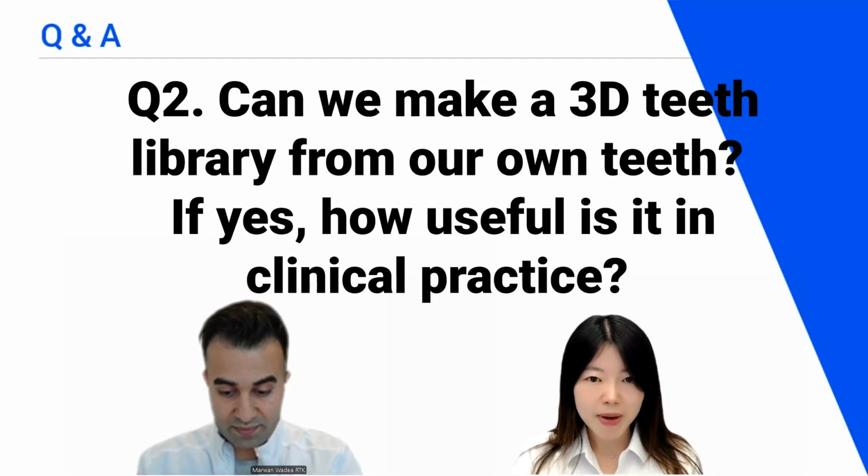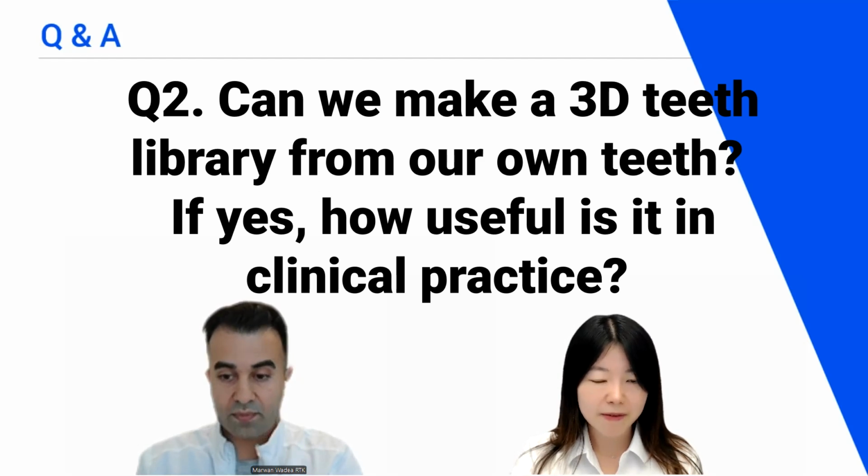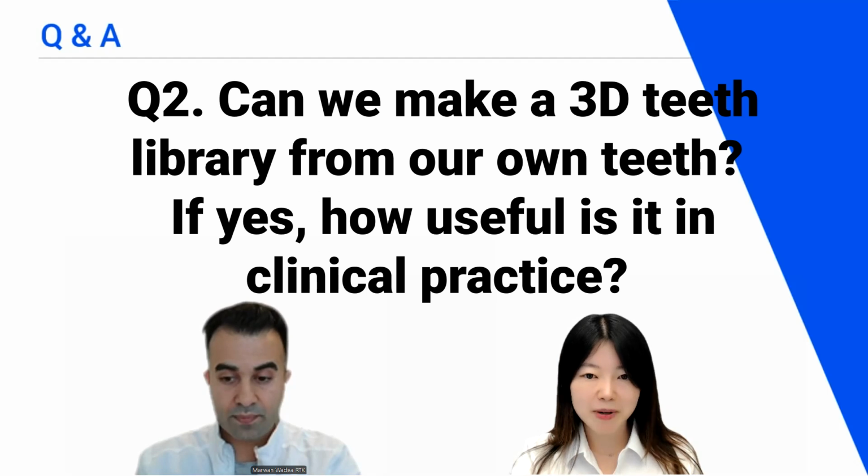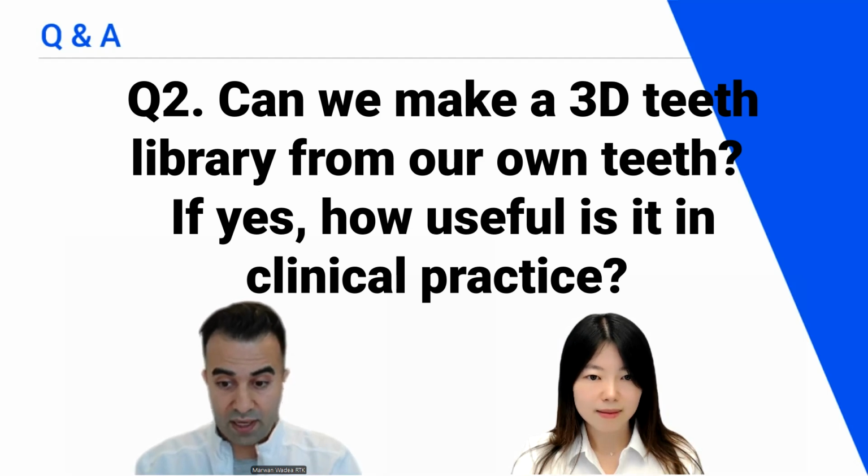Let's move on to question number 2. Can we make a 3D teeth library from our own teeth? If yes, how useful is it in clinical practice? Yes, 100%. We can scan our own teeth, and we can follow the same steps that I demonstrated in this webinar to extract a 3D teeth library.